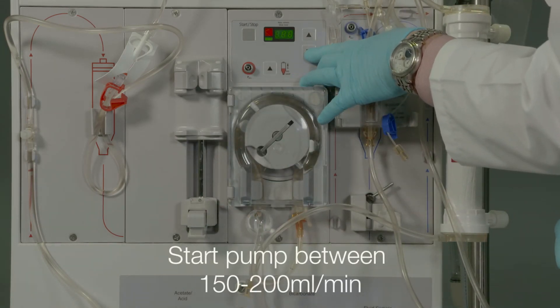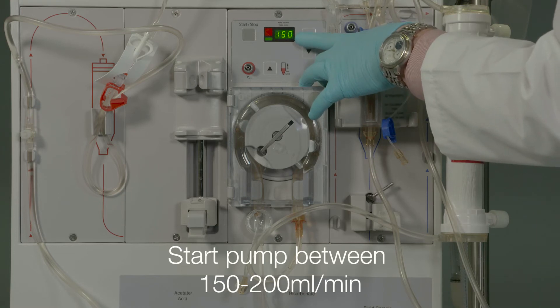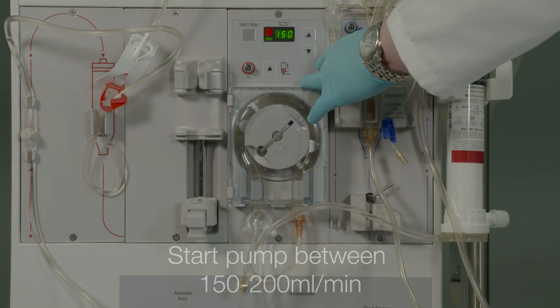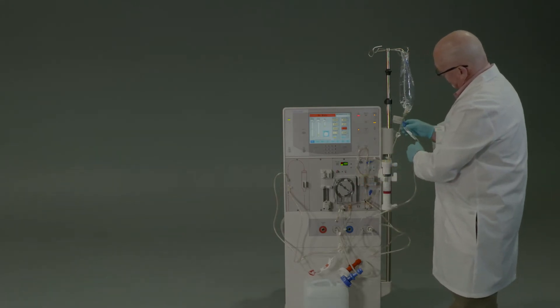Start the blood pump between 150 and 200 milliliters per minute and immediately open the small blue clamp on the short tube of the dual lumen priming spike set. When the initial prime is complete, approximately two minutes, the blood pump will stop.